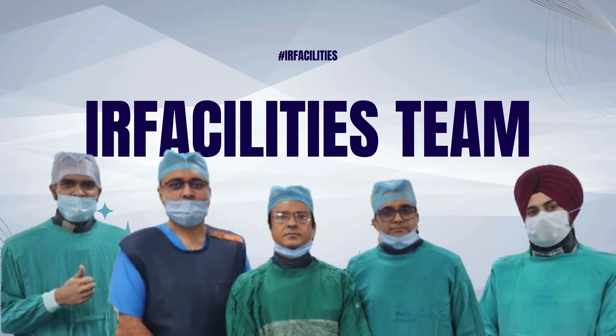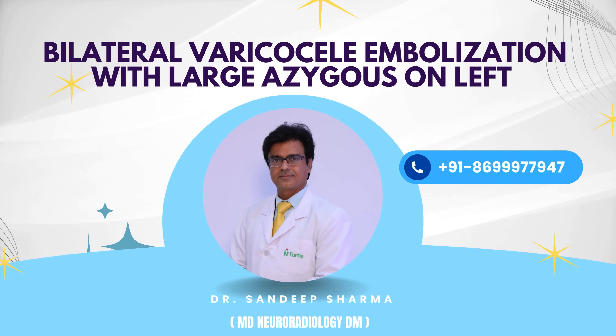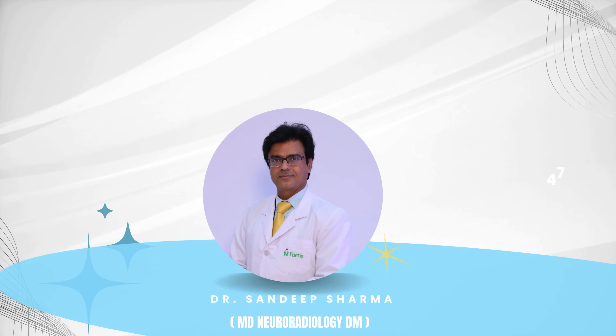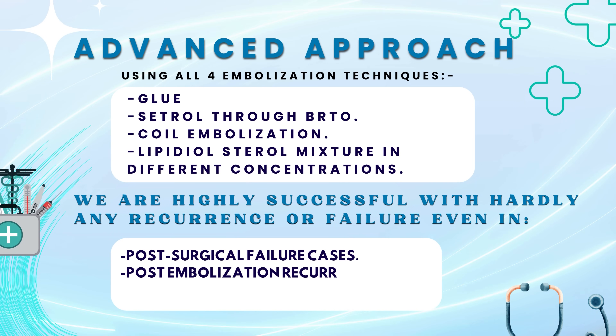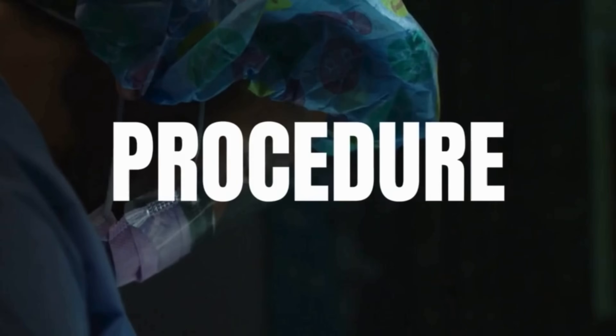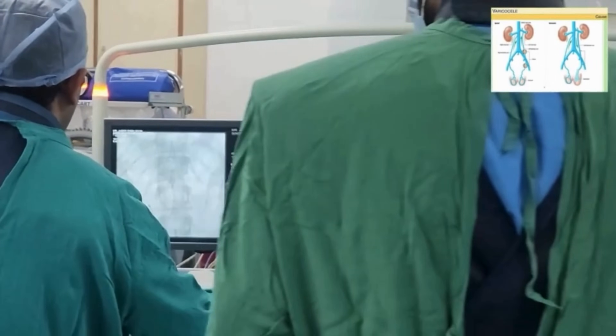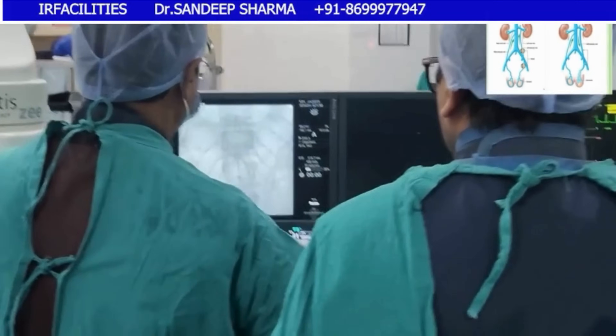Good morning friends. Today again we are going to embolize bilateral varicocele in a young male. This case has an unusual left-sided origin in the sense that there is a large azygous vein arising from the left renal vein.